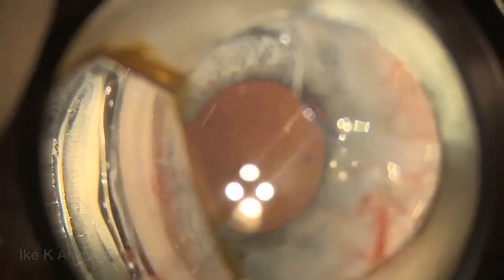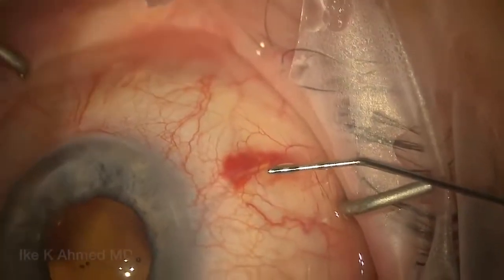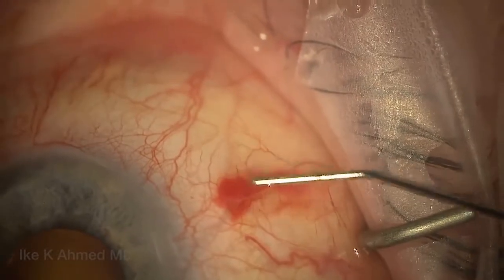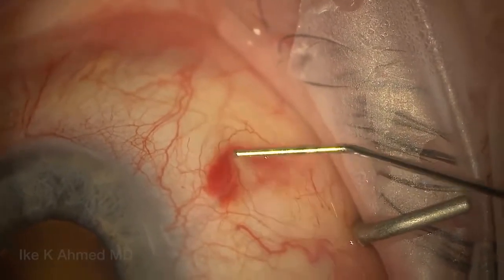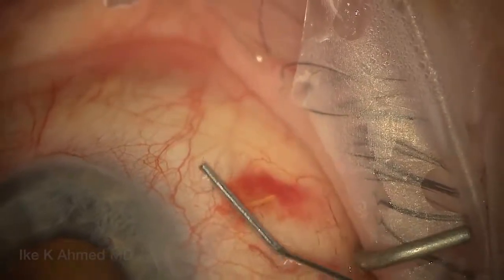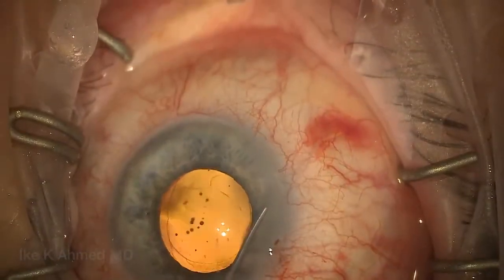This is very self-limiting in most cases. The gonio mirror now shows the implantation in the angle, nicely positioned anterior to the TM. We see about a millimeter in the anterior chamber, well positioned. This is exactly what we like to see for the intraocular portion of the Zen implantation — about a couple of millimeters of the implant in the subconjunctival space. I like to make sure the implant is free and mobile; you can see how freely maneuverable it is by the cannula. We'll milk it a bit to ensure nice placement, and we know it's likely superficial because of how free and mobile it is.